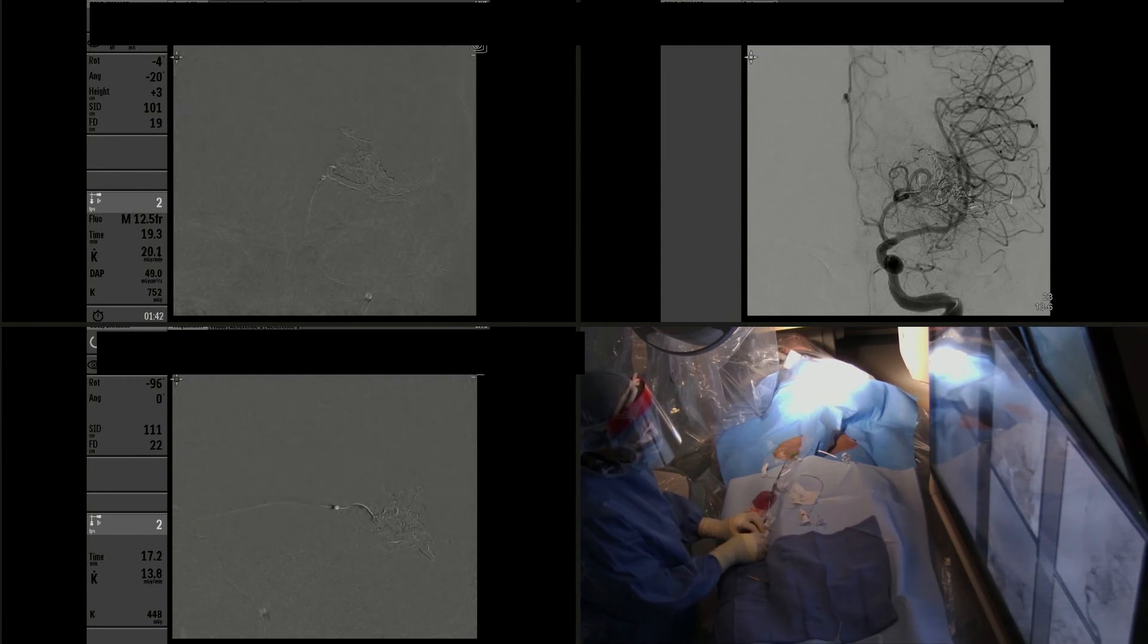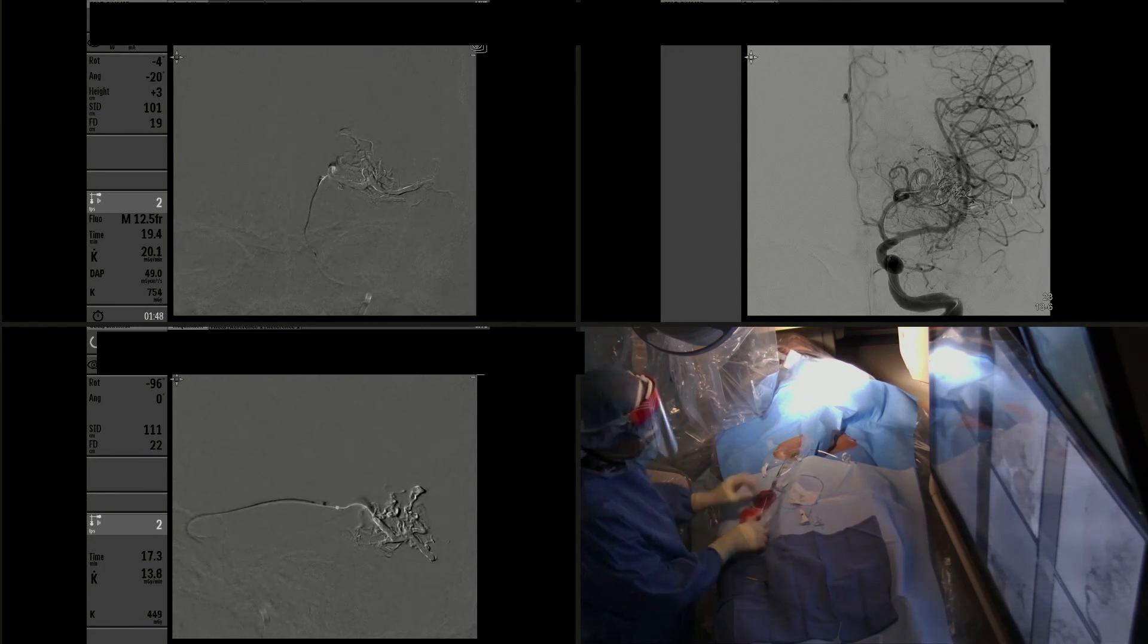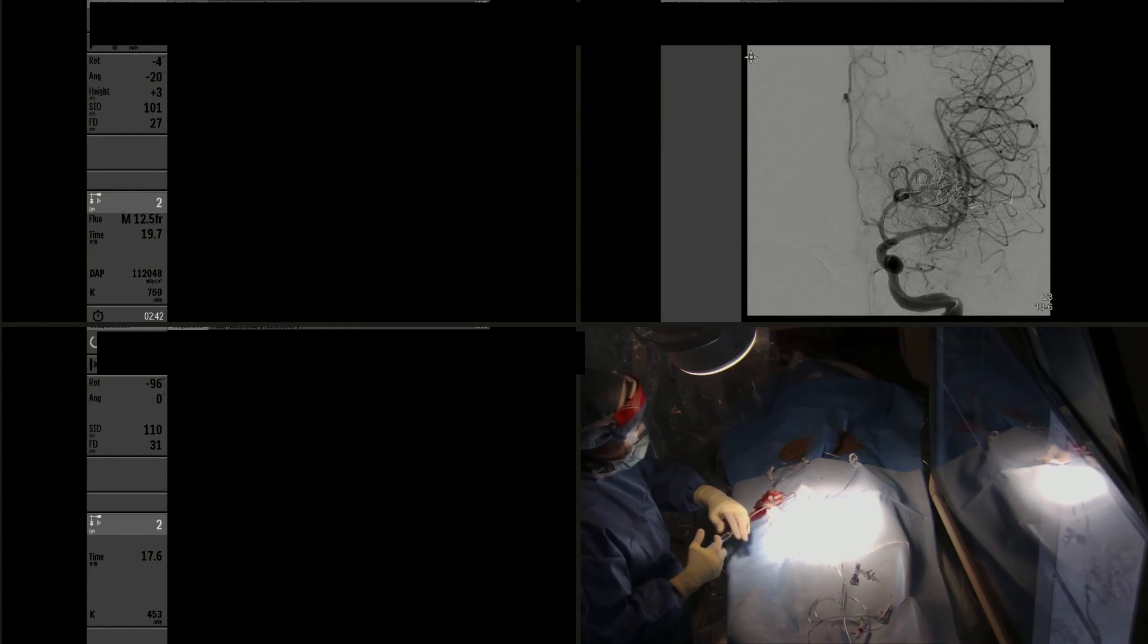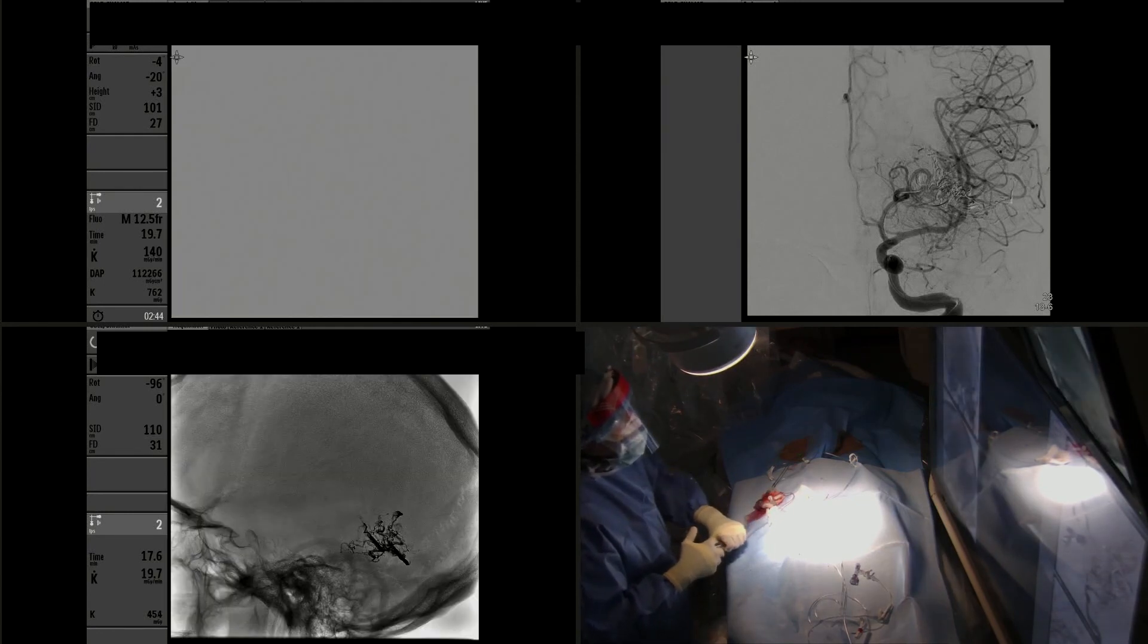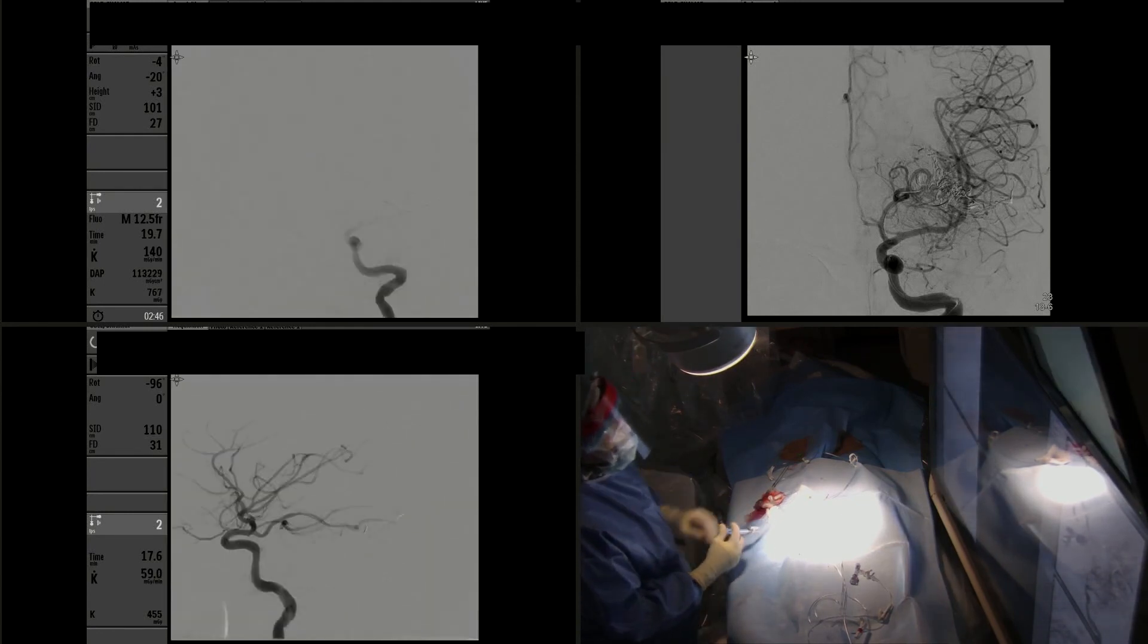You're going to see again we're straightening the vessel and the distal access catheter again moves more distally. That helps us to be able to remove the microcatheter, and this is our control angiogram at the end of the procedure.